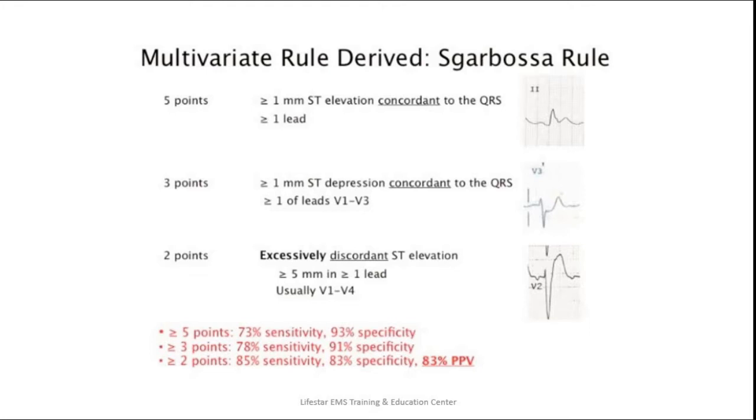She assigned various points to each one of these findings. The most significant one at the top is concordant ST elevation in one or more leads. It doesn't have to be contiguous leads. It only takes it in one lead in a paced rhythm. That is a finding for STEMI.